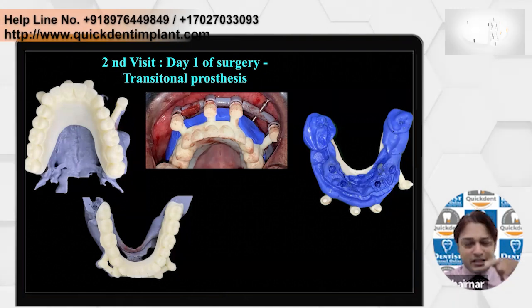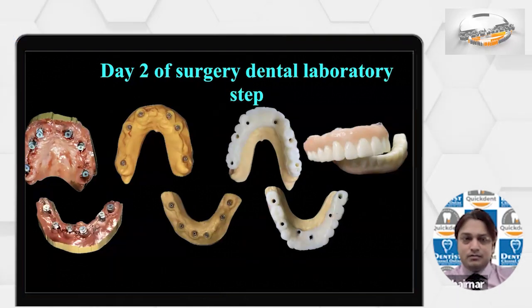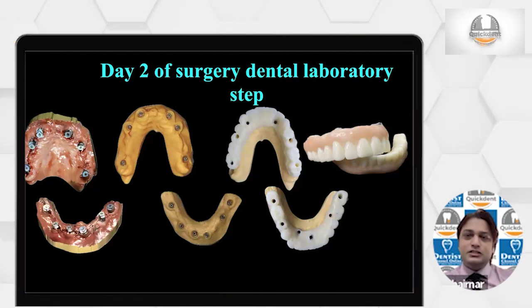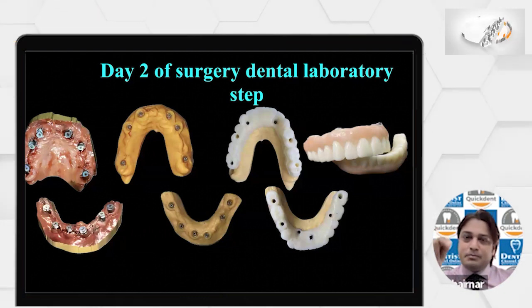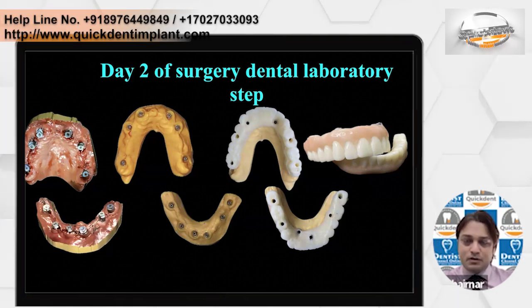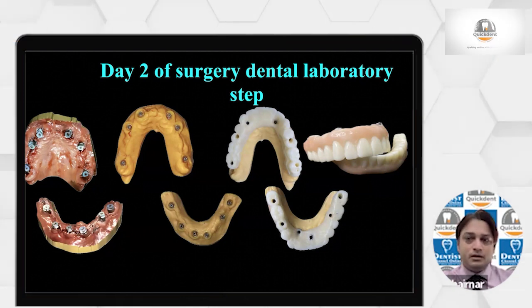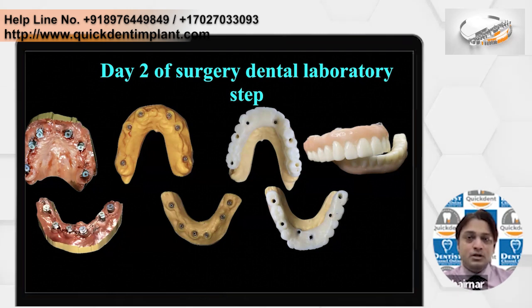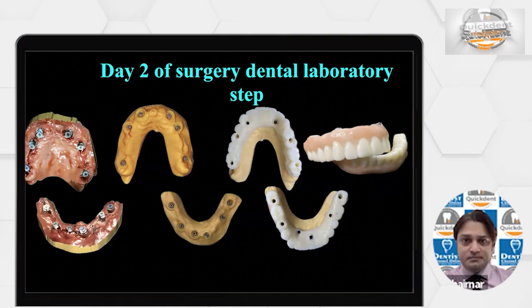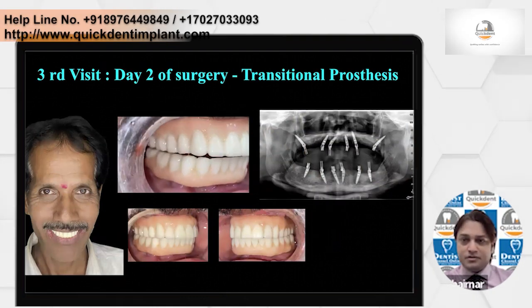Now this is sent to the technician, who will make a hole through this. Also we have taken the standard digital scan for the upper and lower jaw. He printed the model, and on this model he nicely prepared the access holes. So nothing was compromised. Everything was good. See the positions, respectively positioned, and that's how he defined. He made the prosthesis with the undersurface absolutely conducive for good hygiene. This is the patient on day 2. You can see before and after.